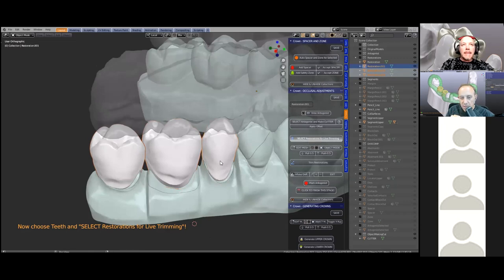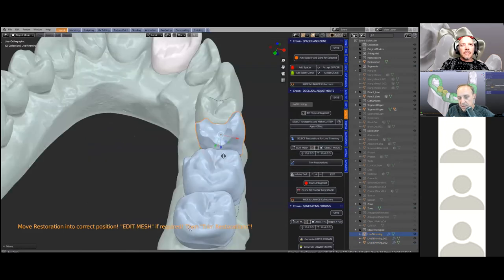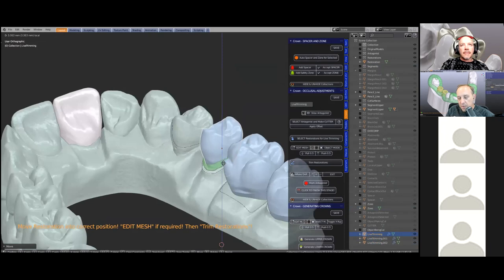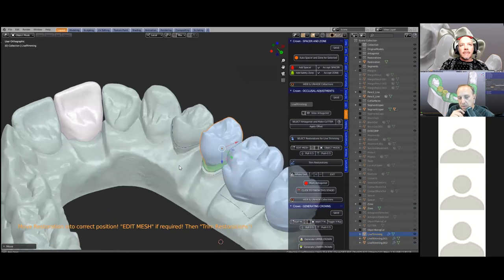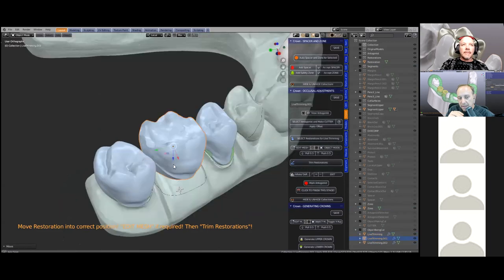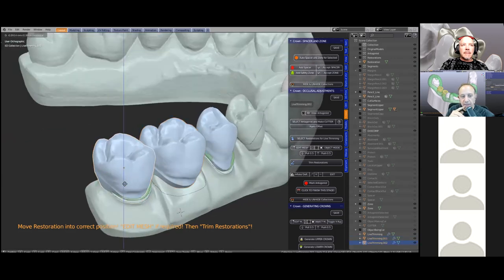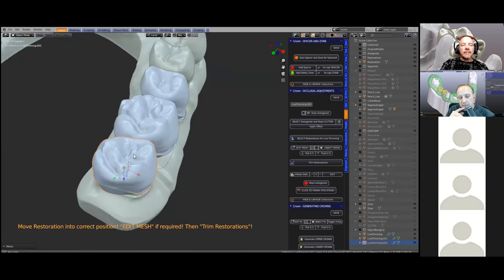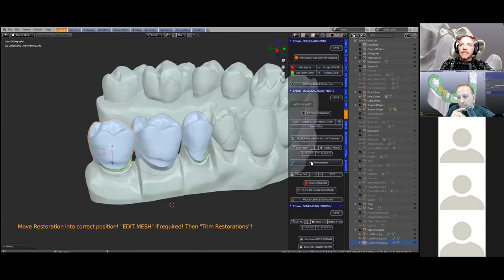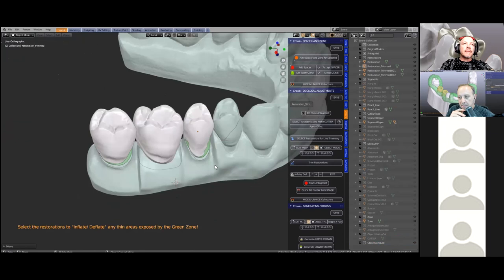A live trimming feature will let you pull the tooth up or down — that's you finding a happy medium between losing all of your occlusion or having the crown too thin. Here we set the vertical height of the actual tooth. The higher he pulls it, the more it trims out. So we've got an invisible antagonist sitting there — you raise the tooth up and find a happy medium. Then by pressing 'trim restoration,' that finalizes the boolean operation.